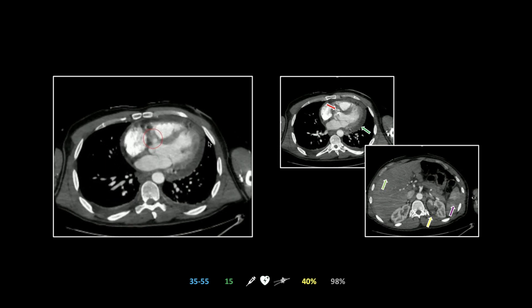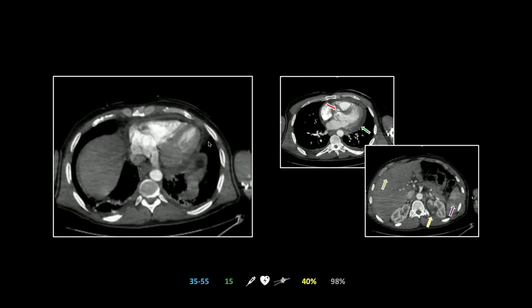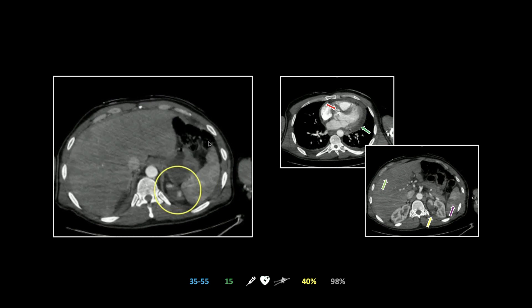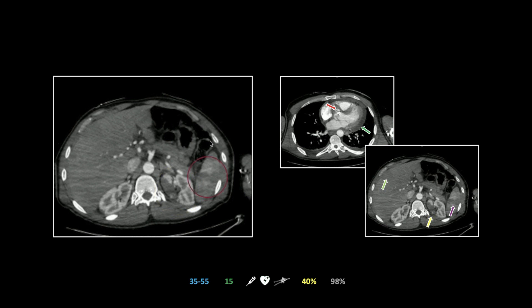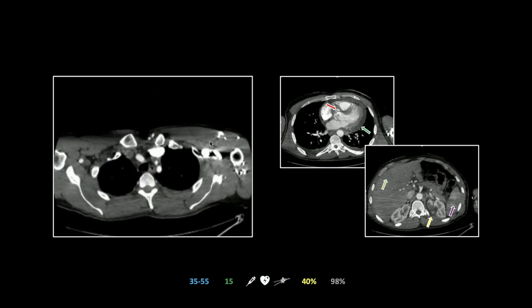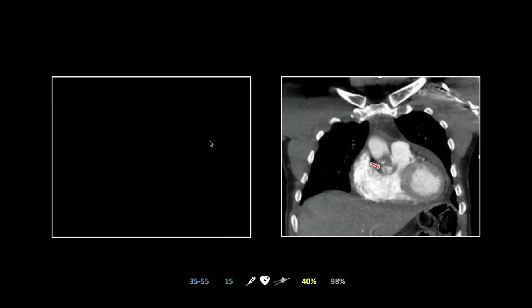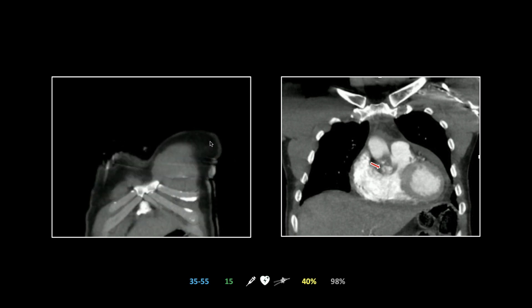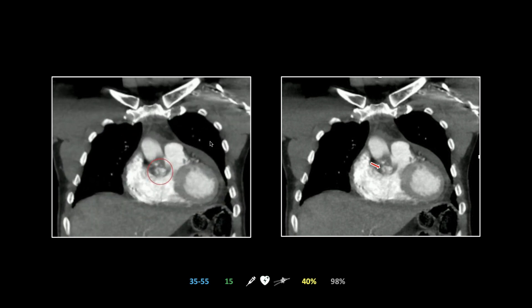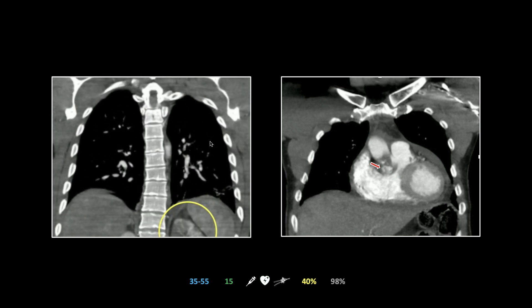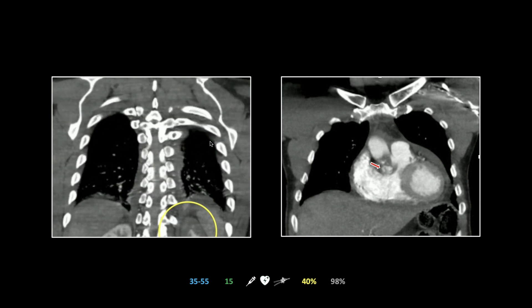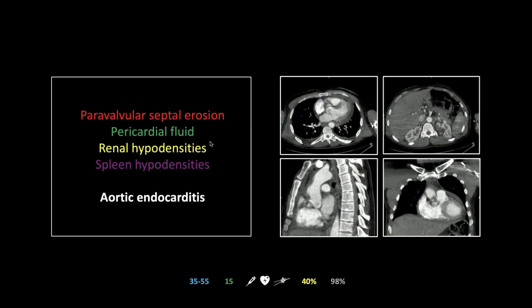There's the ring abscess; note the piopericardium throughout. Then the liver, kidney, and splenic infarcts. On the coronal view, you can see the abscess anterior to the valve ring, and there are those renal infarcts. That concludes a case of aortic infectious endocarditis.